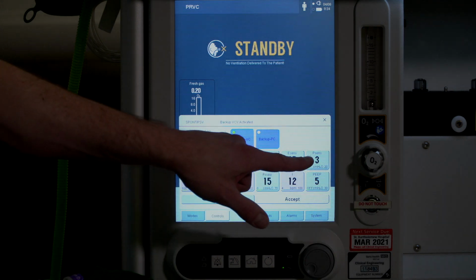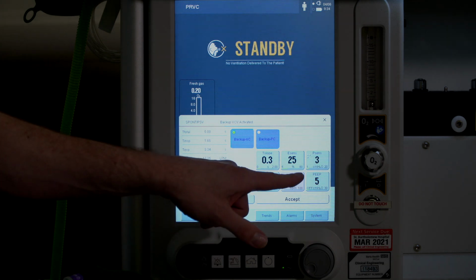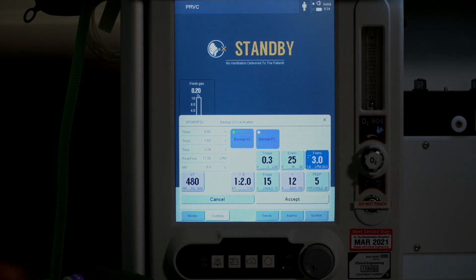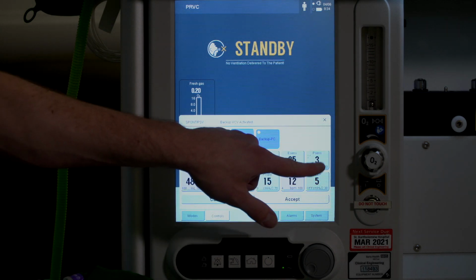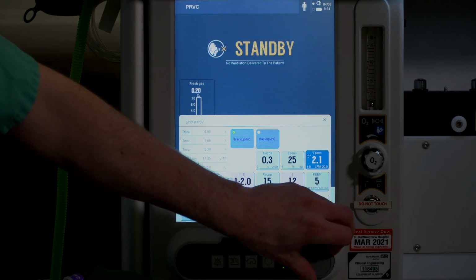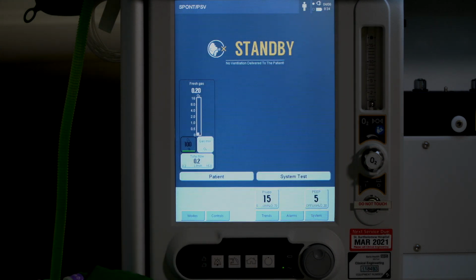But if you see here, we often use a flow trigger on the Maquet machines, and this here defaults to a pressure trigger. You can switch between the two, so if you press and hold, you'll see that you change to flow sense. Press and hold again, you'll see that you change to pressure sense. So I'm going to default this to flow sense, and you can see it defaults to 3. We'll turn down to 2, press OK, and you're ready to go. Again, press accept, and you are back in that mode, ready to start ventilating again.